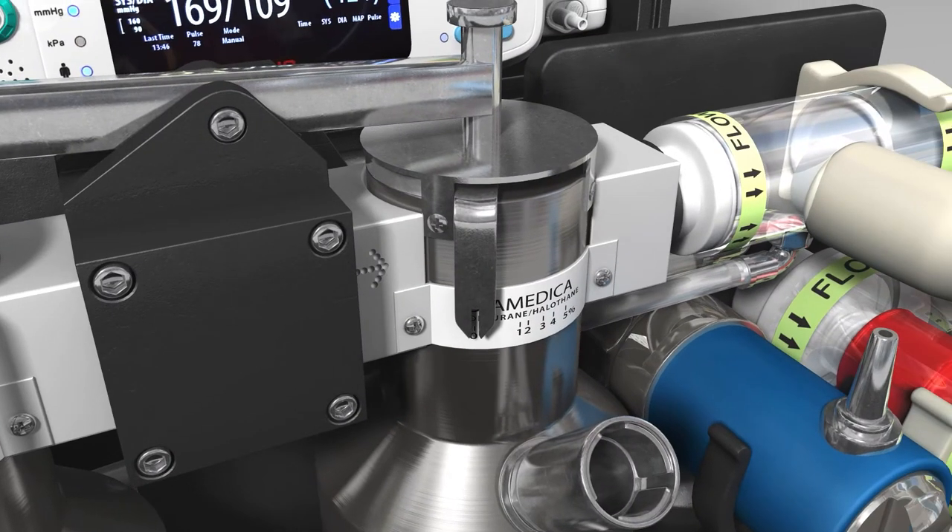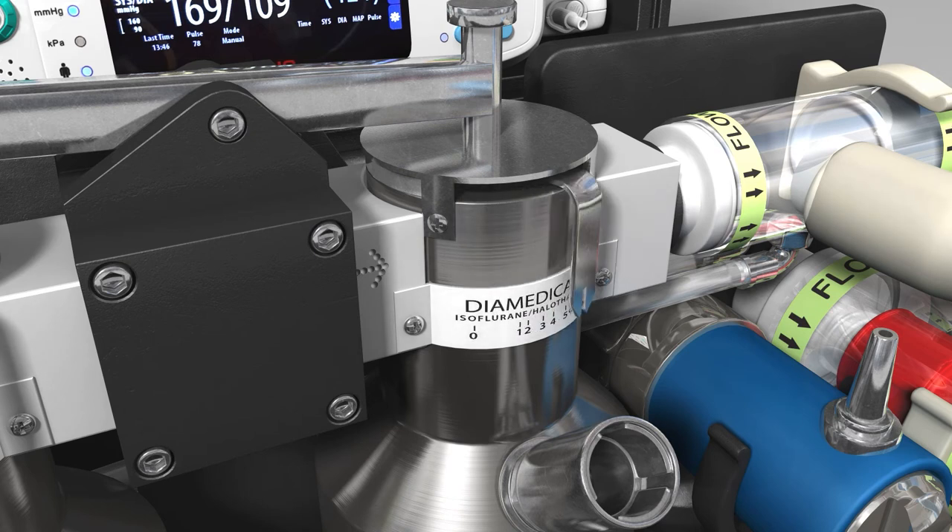The isoflurane or halothane vaporiser is calibrated for either of those agents. The scale runs from 0 to 5%. It is filled by unscrewing the cap and using the funnel supplied.